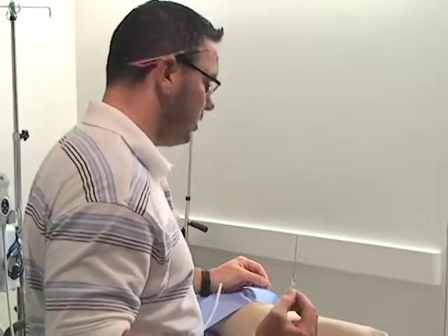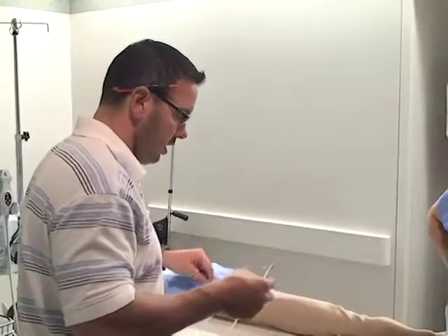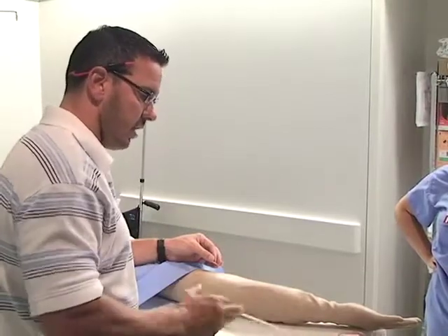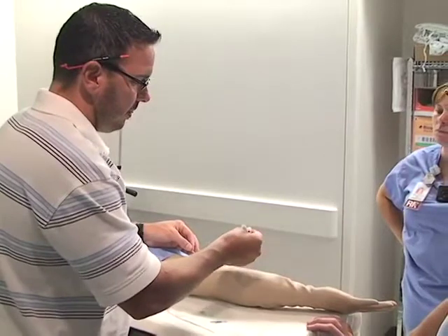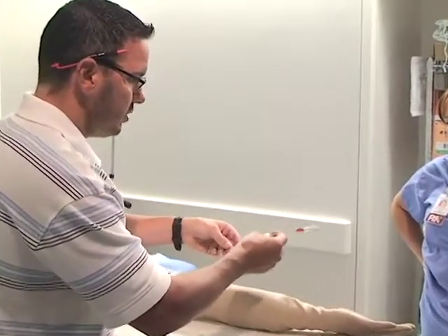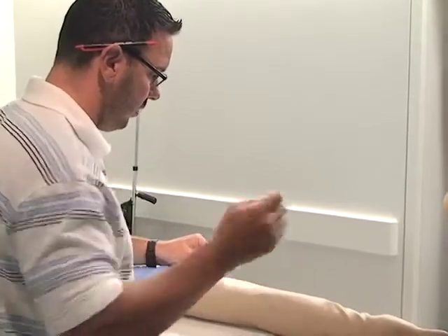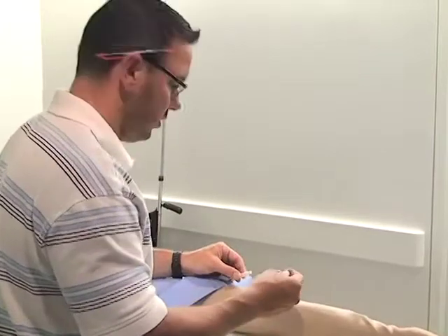There's obviously more to this, and you have to use lidocaine to numb the skin, and you're going to nick the skin. This is all going to be a sterile procedure, but you get the gist. Once you have just the wire inside the patient, you have a sheath that goes over top of the wire, and that's how you ultimately maintain your access. So you use the needle first to get access, then the wire, and then float the sheath right over top of the wire into the patient, and then you pull the wire out, and you've got your access here. You can put a cap on that, you can put your PICC line through it, you can do whatever you've got to do.